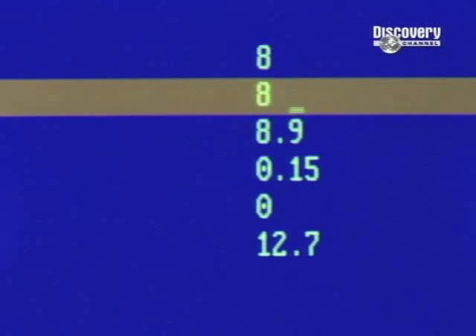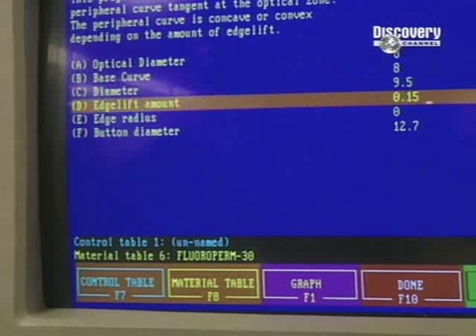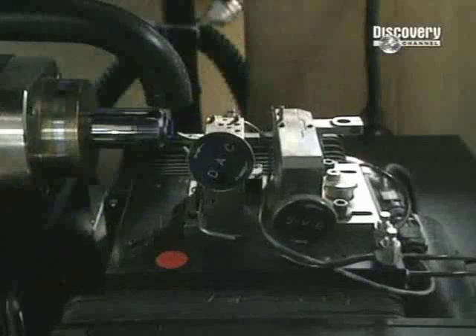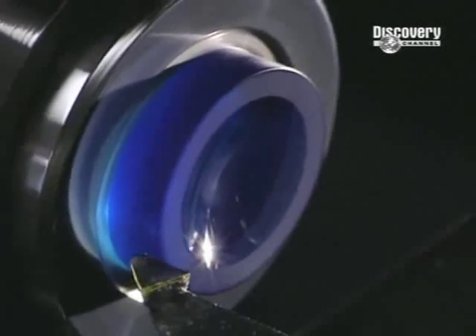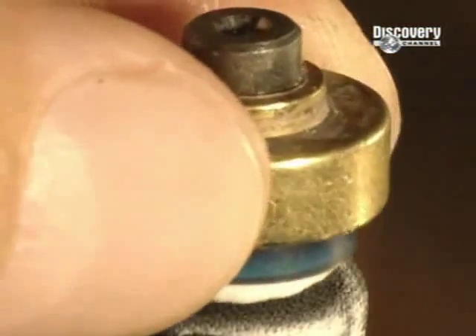The first stage begins with the data processing control of the shaping. The lathe commences by shaping the inner curvature of the lens. Rotating at 6000 revolutions per minute, it's armed with an industrial diamond. It shapes the inner surface, the part that touches the cornea.